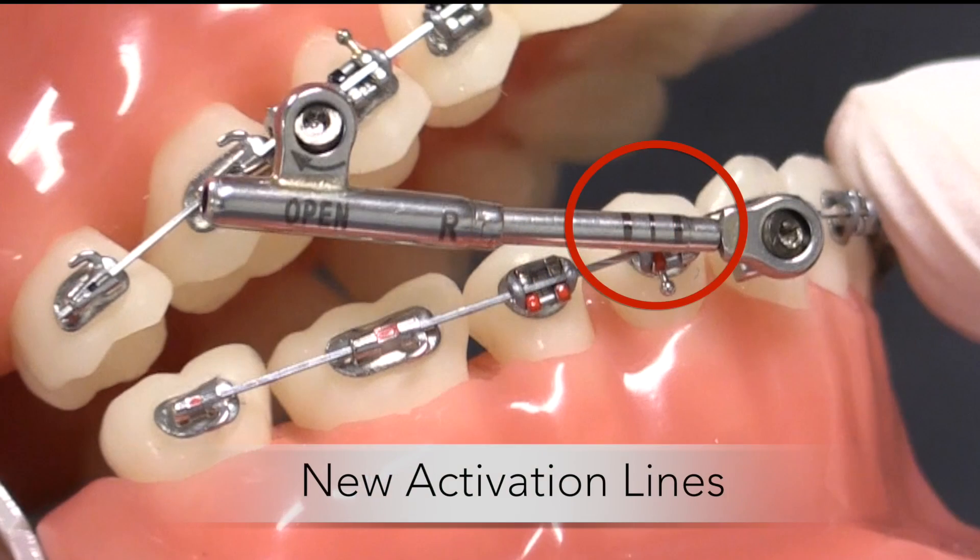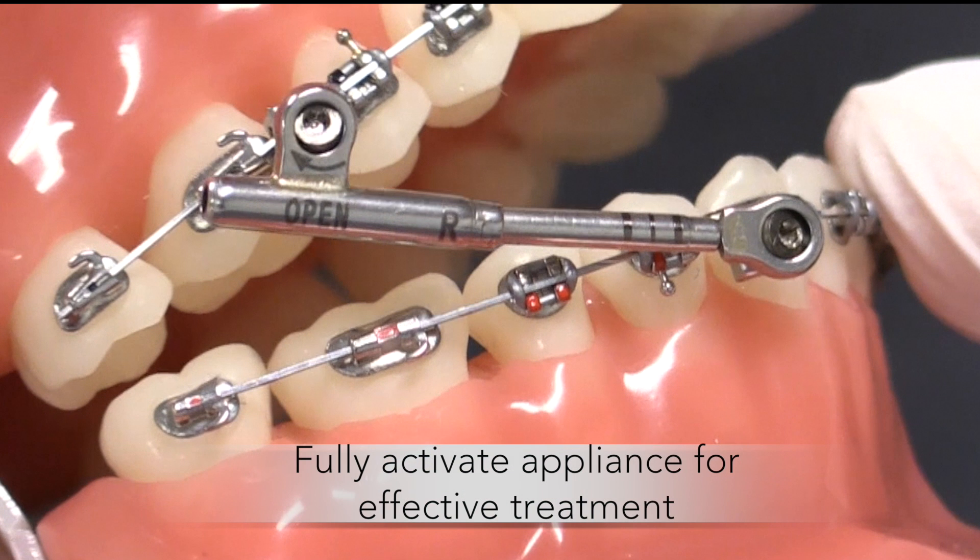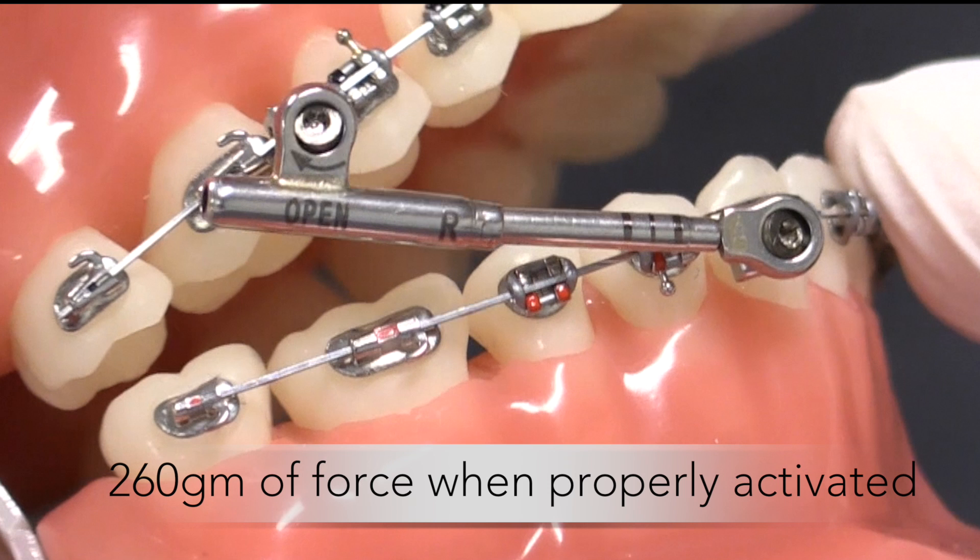PowerScope II comes with new activation lines to assist in determining proper activation of the appliance. Each line represents a reference level of activation ranging from no activation to partial activation to full activation. It is recommended to fully activate the appliance for effective treatment. A properly activated PowerScope II appliance will deliver 260 grams of force during treatment.